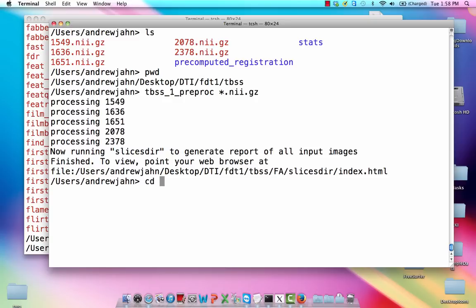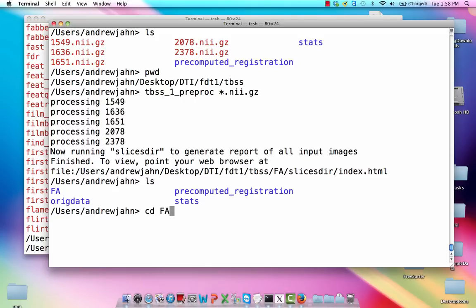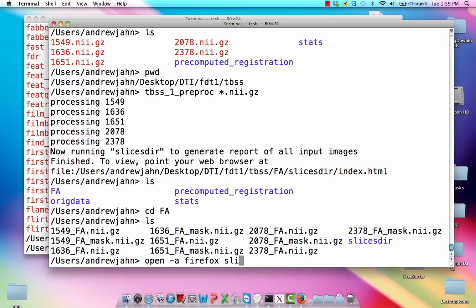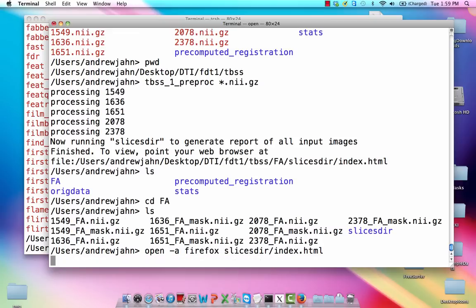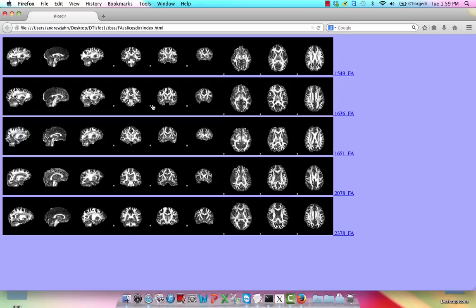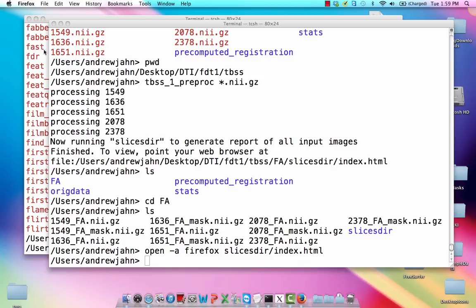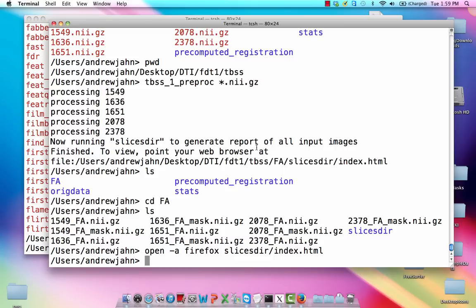Let's go into this. So it's generated an FA directory, which now contains all of our preprocessed FA images for that first step, and also Slices_DIR, right over here. Okay. So let's take a look at that. Let's open it up with Firefox, for example. And I think it's called index.html. So quickly open that up, and we get a good sense that it doesn't look like anything's gone horribly wrong. It seems like the erosion has been totally appropriate, and we're good to go on to the next step. You could also load these in FSL view if you wanted to take a more detailed analysis. But just for a quick run-through, that is perfectly acceptable to my eyes.